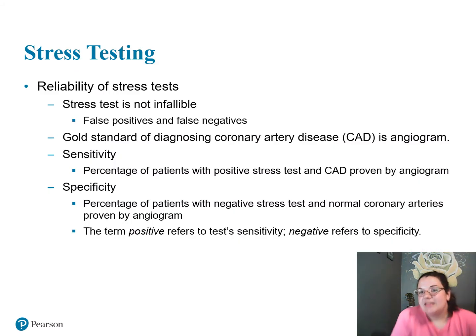So, what's the reliability of the stress test? Can we put all of our trust in a machine and what that machine's telling us? Our machine could be telling us our patient is having a tachycardia, but they obviously are breathing normally and doing okay, right? They can be having a sinus arrest, but they're walking on the treadmill. So do we want to believe our EKG machine all the time? No. So we have what's called reliability of the stress test. The stress test is not infallible, meaning it can give us a false positive and a false negative.